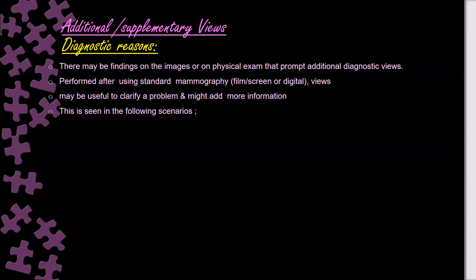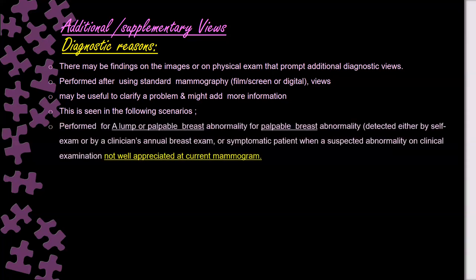The diagnostic reason: findings on one image or physical examination may prompt an additional diagnostic view. It should be performed after using the standard view. Okay? You cannot just from the beginning ask for a supplementary view. You have to do the standard view, then recommend or ask for an additional or supplementary view, which may be useful to clarify a problem and might add more information. And this can be seen in the following scenarios.